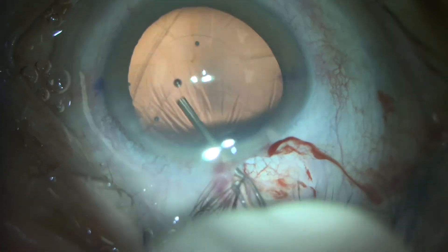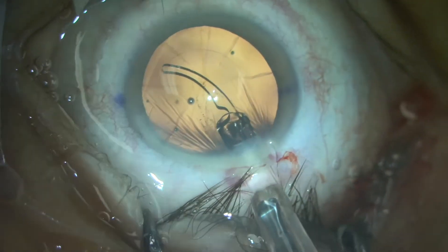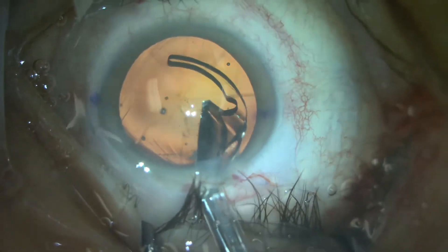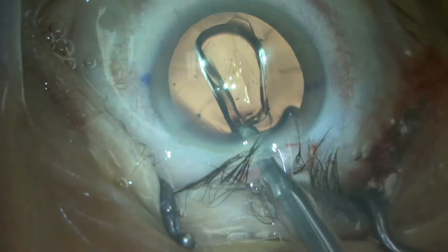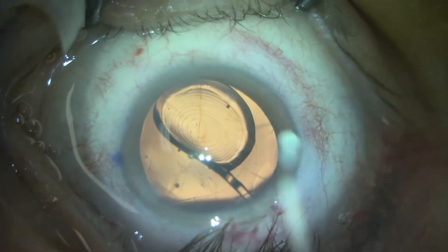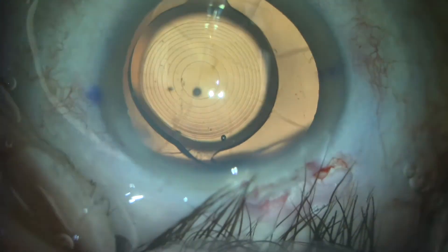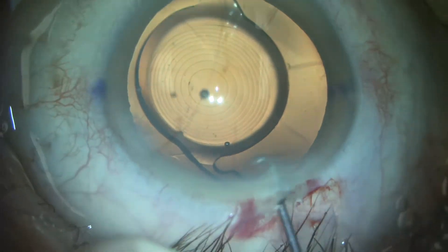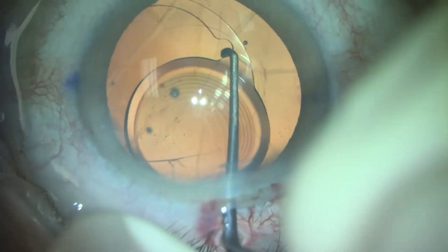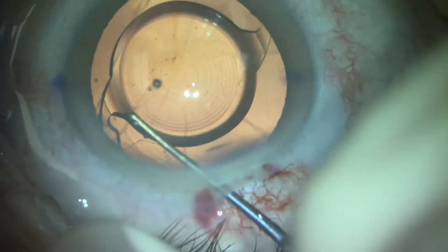We elect to place the Symphony one-piece lens into the capsular bag. Plan A is to successfully insert the Symphony into the bag. If that implant did not adequately center and remain stable, I was going to remove it and place a three-piece lens in the sulcus. We are able to stabilize the Symphony lens in the capsular bag areas that remain, making sure to orient the haptics in the areas where there is adequate equatorial capsular support.